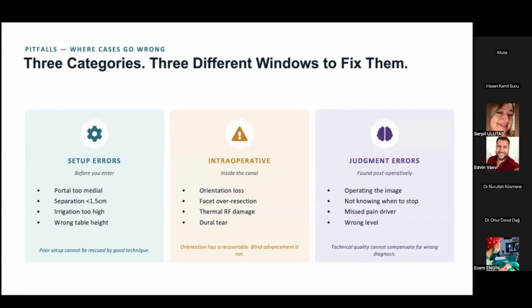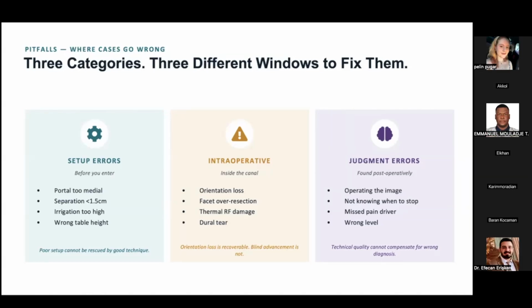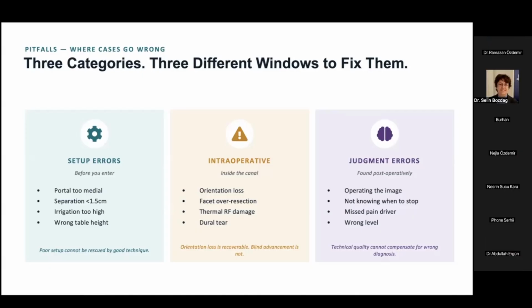This is unnecessary if you plan before you cut your skin. And if it's too far, you can't reach and can't start your surgery. So you need to be at a very good distance to the pathology, the start point, and your end point.